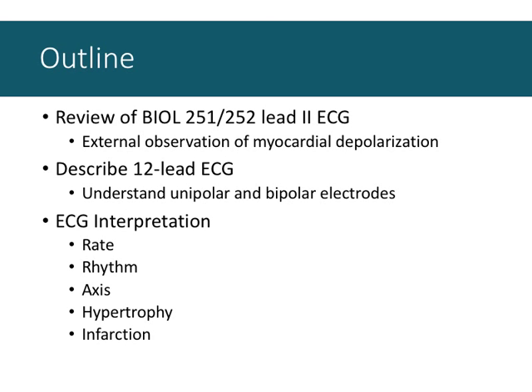Hypertrophy is generally a warning sign for chronic heart disease. If there's been necrosis or infarction, and where in the heart that is, we can get all of that from the 12-lead ECG. So a much more comprehensive picture than simply lead II, the classic ECG trace that you all know really well.